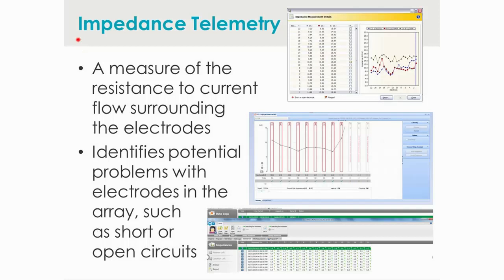One of the first things the software takes the clinician to after plugging in the processor is impedance telemetry, with examples shown for Cochlear, Med-El, and Advanced Bionics software. Impedance telemetry is a measure of the resistance to current flow surrounding the various electrodes, providing a measurement for each electrode's impedance level. The most beneficial aspect is that it identifies potential problems such as short or open circuits, allowing evaluation of each electrode to ensure it's functioning within manufacturer specifications.